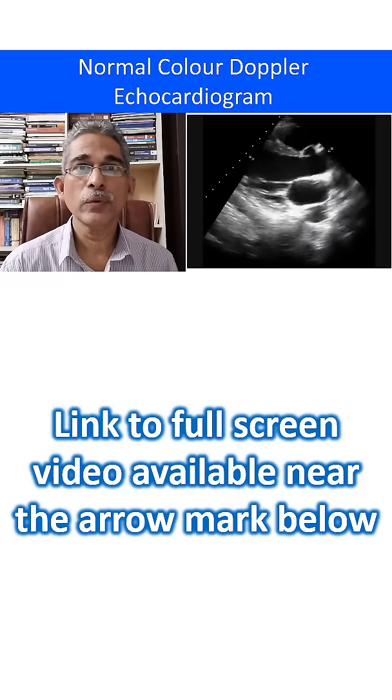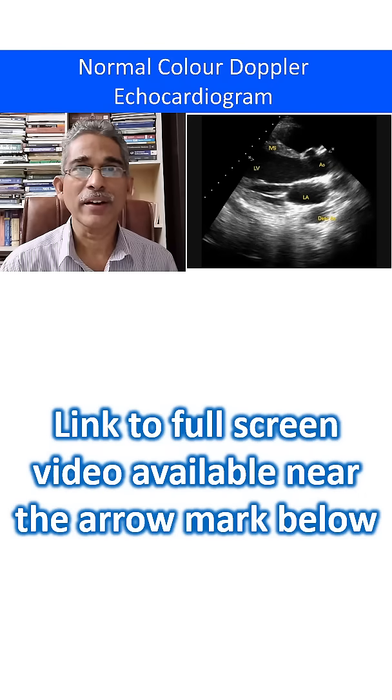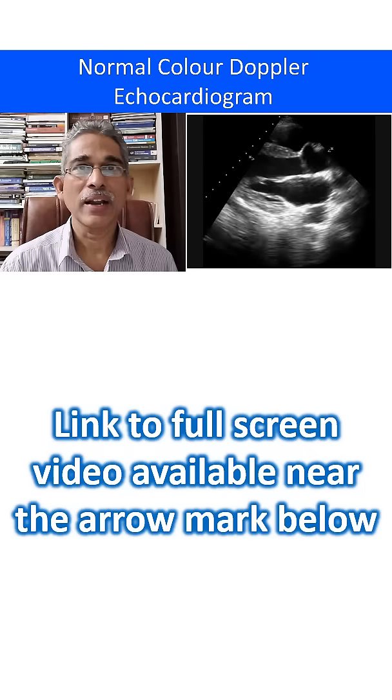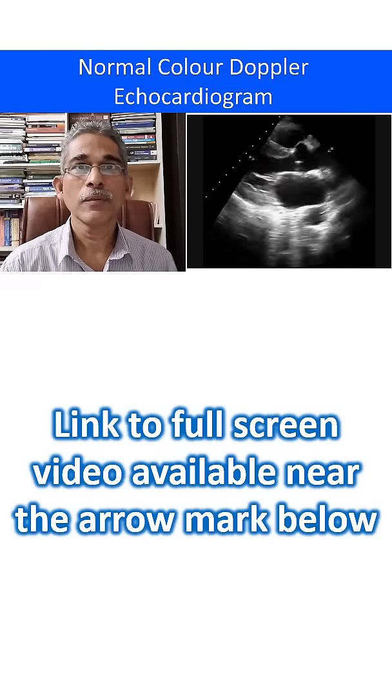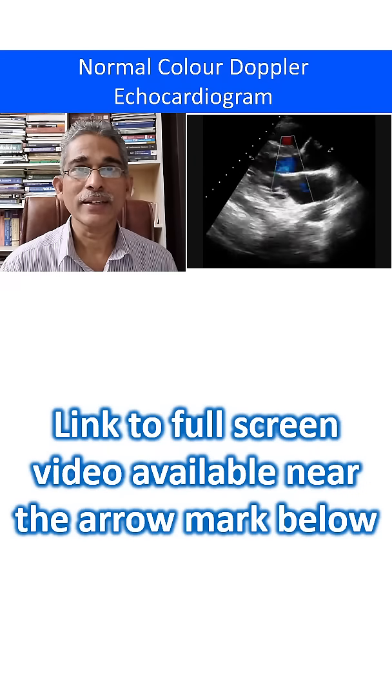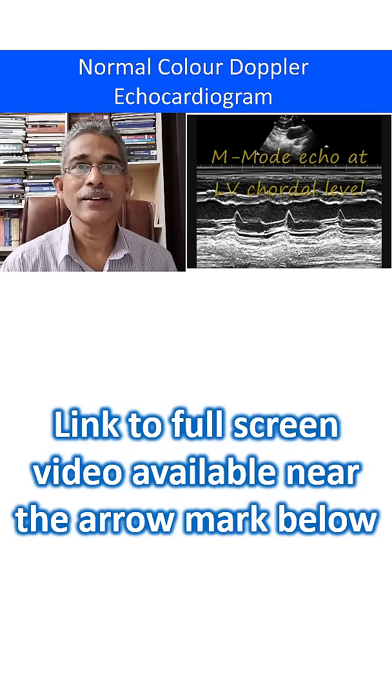We will review a few video clips from a normal color Doppler echocardiogram in multiple views like parasternal long axis view, which is the first view often obtained in adult echocardiography, parasternal short axis view, apical four chamber view, and suprasternal view.